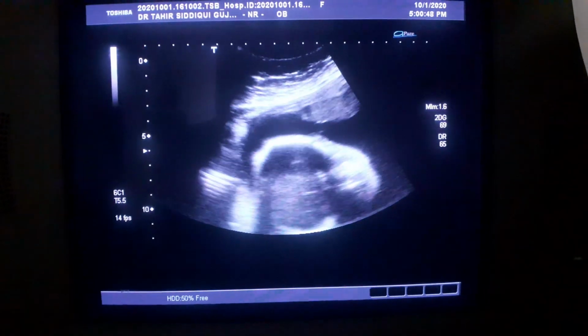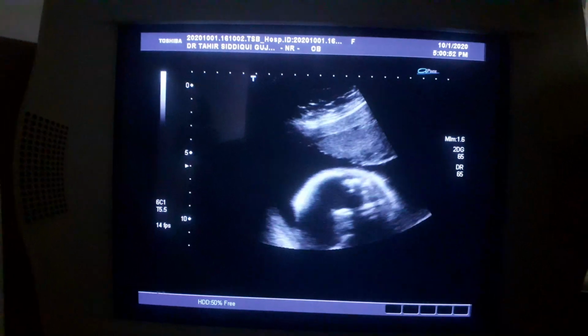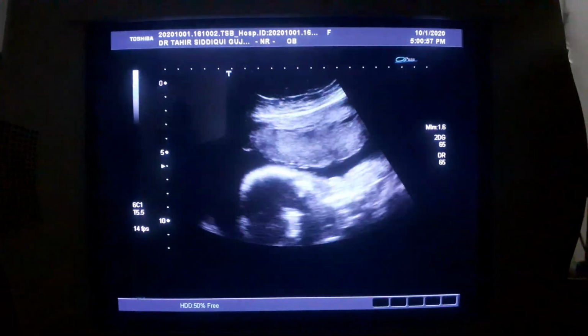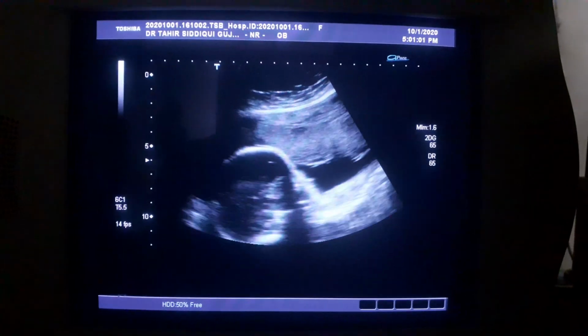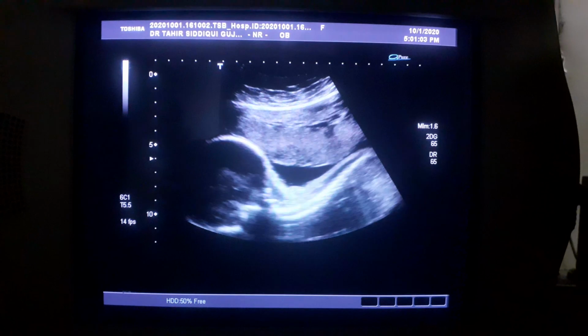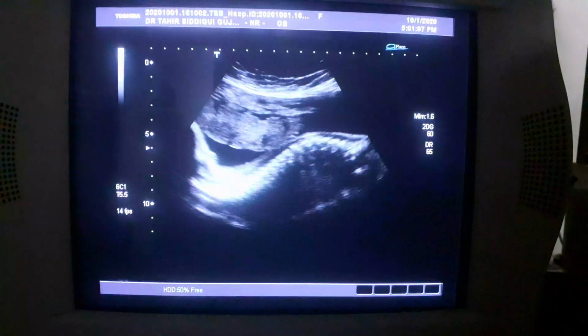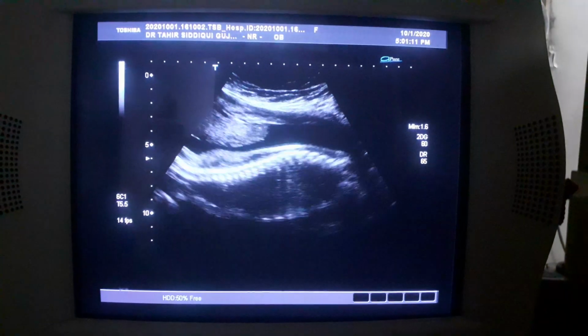These are the eyes. Second, hyperactivity. Both fetuses are hyperactive. Now the spine is otherwise normal except showing lordosis. This is the spine from its cephalic to caudal portion.